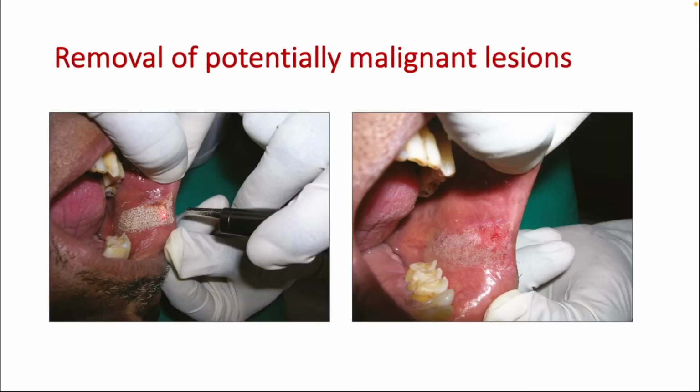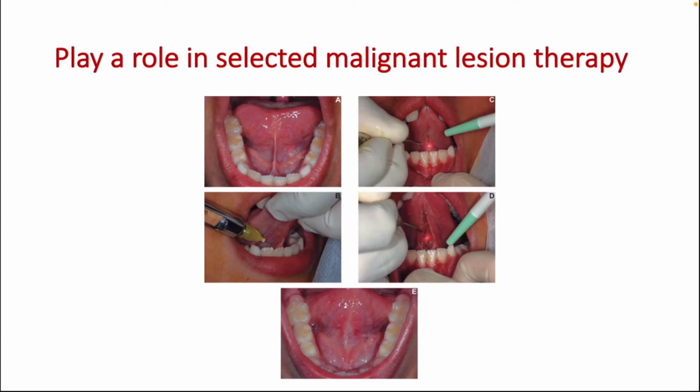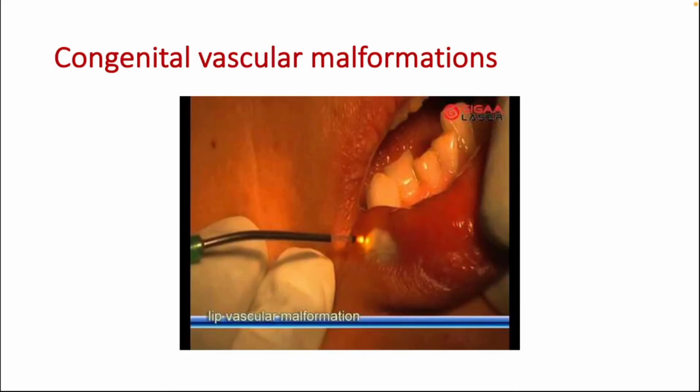It has also been used for removal of potentially malignant and malignant lesions such as leukoplakia and squamous cell carcinoma. Congenital vascular malformations in craniomaxillofacial surgery: laser therapy is indicated in the treatment of congenital vascular malformations such as hemangioma or nevi flammei, which are treated by argon or dye lasers.